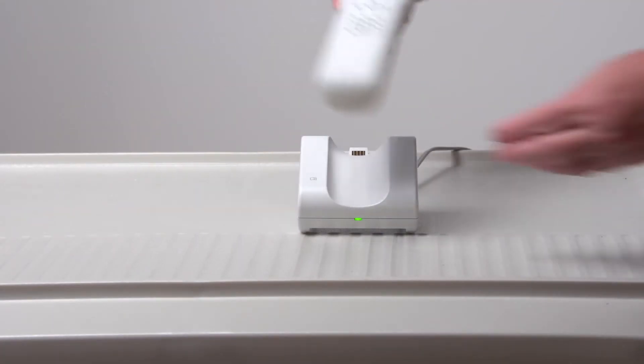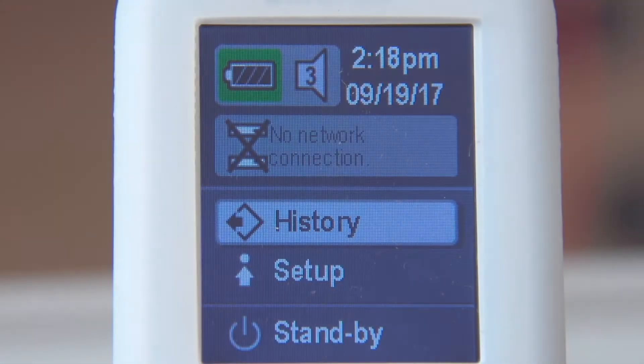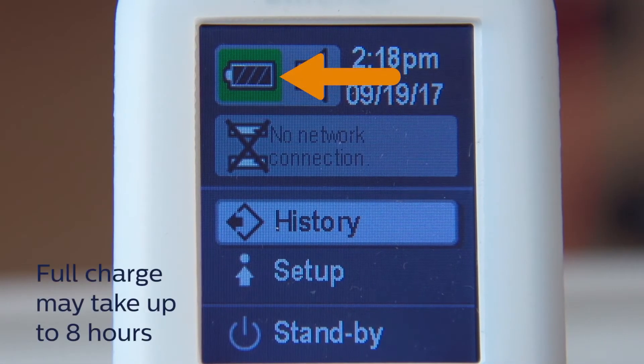Place the Billy Check onto the charger base. A lightning bolt icon appears on the battery icon to indicate the battery is charging. The Billy Check battery should be fully charged prior to initial use. When fully charged, this icon appears.